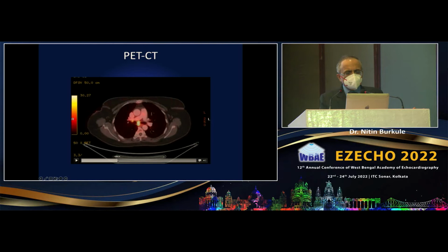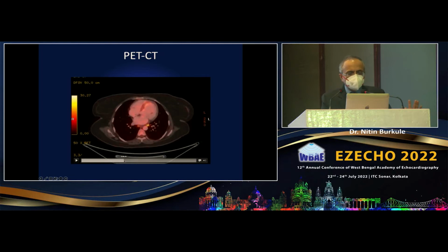And then if I go down, there are so many mediastinal lymph nodes, so many mediastinal lymph nodes. So this can be a sarcoid, definitely, very likely. In the myocardium, you have got a very focal late gadolinium enhancement here. This doesn't show any enhancement. So all those LGEs need not be active. Some of them may be just dead fibrotic granulomas too.